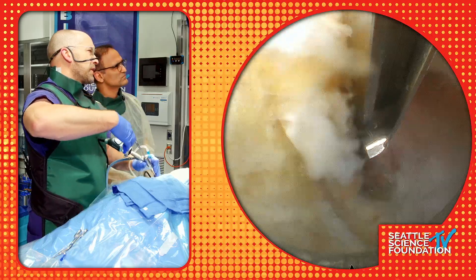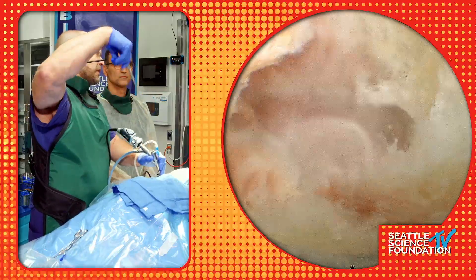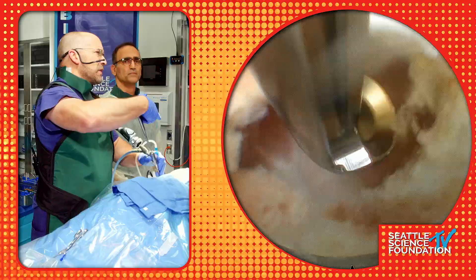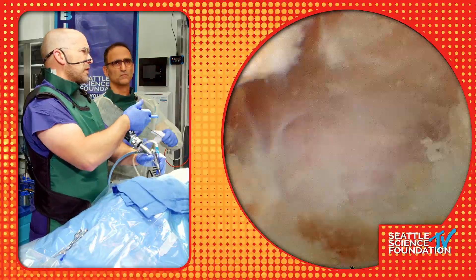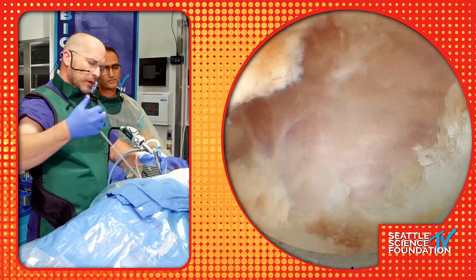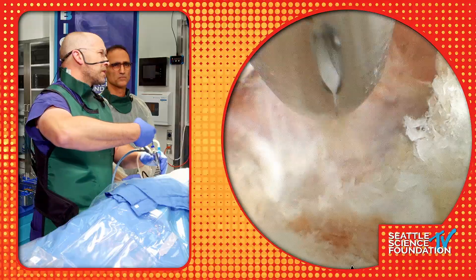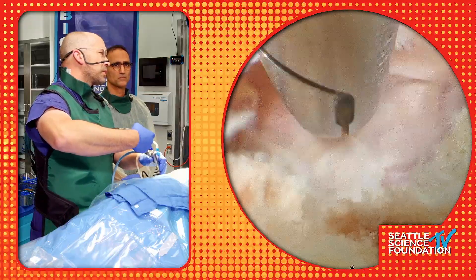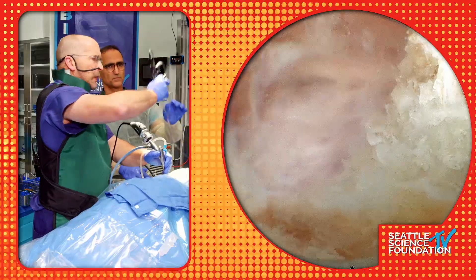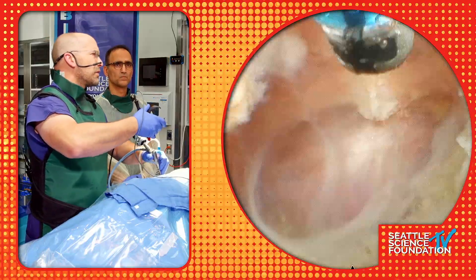You want to stay ahead of the game. We are finishing up the hemi-laminotomy here — it's a safety step so you know where the thecal sac is and where the lateral aspect is so you're not lost in there. Done with our hemi-laminotomy. There's a little fascia on top which I'll pull off. Neural elements are done here.